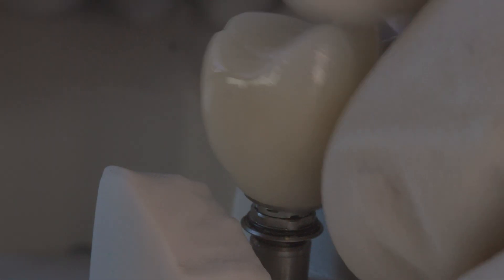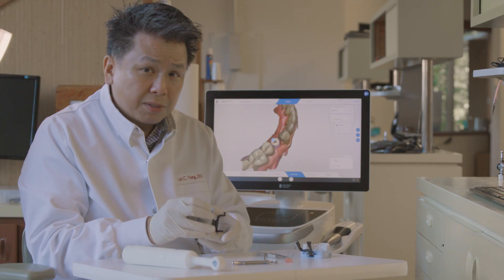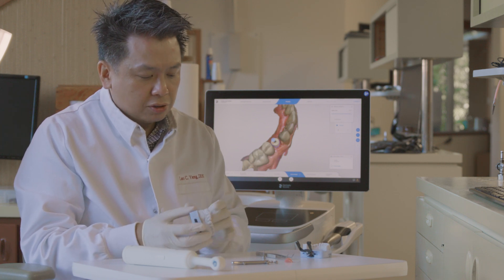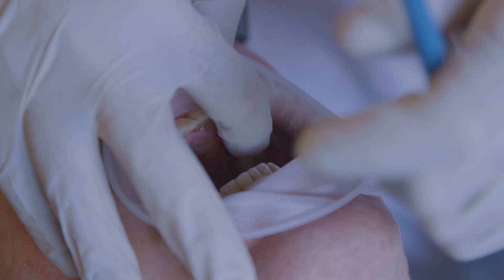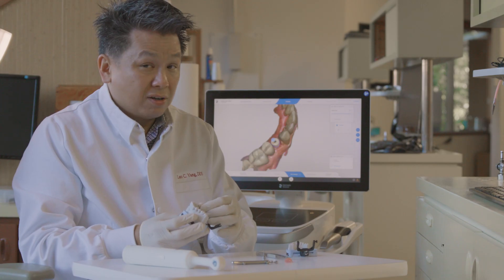Since the smart lock is in place, I'm going to push it down. Sometimes you hear a click, sometimes you won't. Once it's in place, what I typically do is get the patient to bite down on a bite stick several times. After that, it's ready to go.